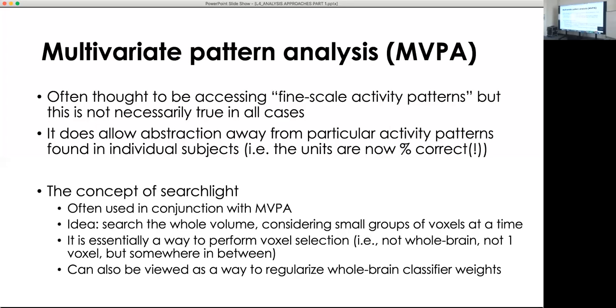And the best way to do this is simulations. Simulate 100,000 voxels, put in an effect, generate an hour of data, and see how well the weight map looks compared to what you know to be the case. But realistic fMRI data is also really hard to simulate because of very structured noise and very structured cyclic components.